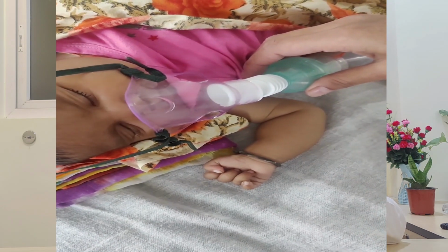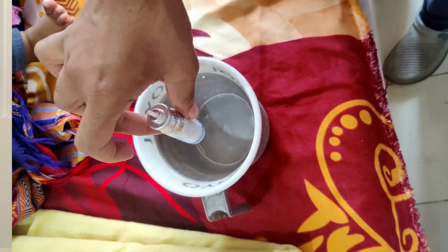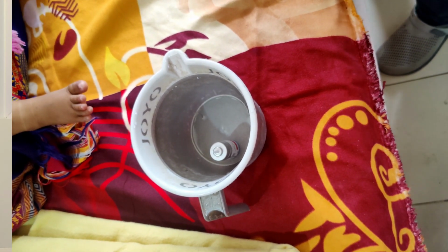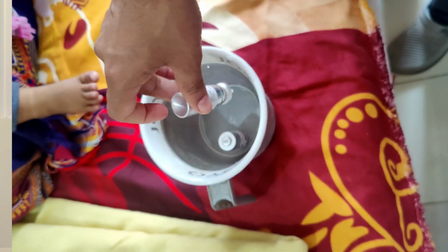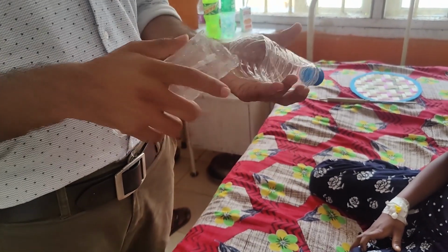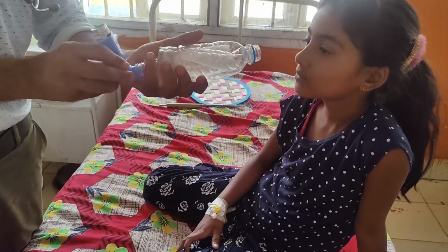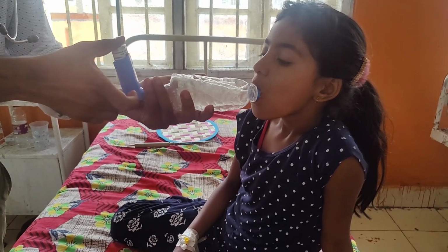How do you know whether the canister inhaler has gas or not? When the inhaler is new, it has the medicine like salbutamol or budesonide, and it will sink in the water. When the inhaler is empty, it will float in the water. If you don't have a spacer device, you can use a water bottle by cutting and heating the ends of the bottle. But the disadvantage is it doesn't have a valve, so there is a chance of mixing up inhaled and exhaled air.